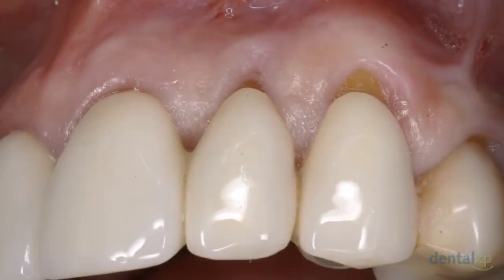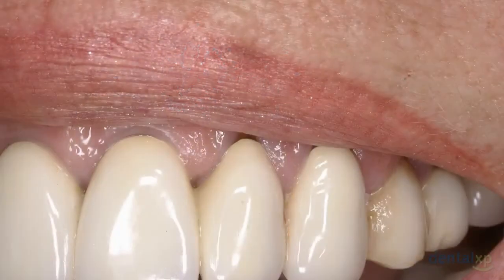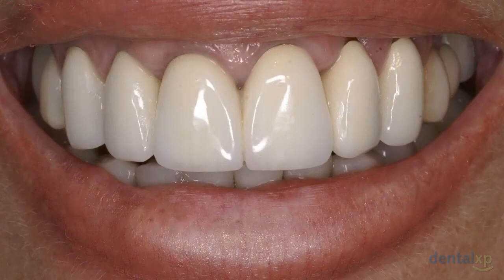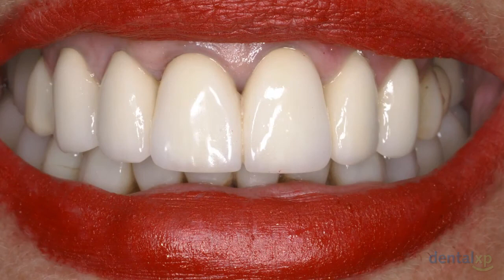Here you can see the preoperative view the day of surgery, and this is at approximately 2 weeks. You can see very, very nice healing, and then very important as well for a patient with an otherwise moderately high lip line. When the patient smiles, you can see the thickness of the tissue that's been added. We have very good root coverage. And the before smile, you can see that that was an issue. And then on the after, we've been able to gain a very, very nice result.